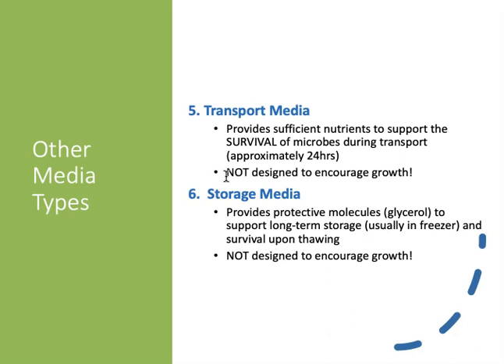There are kits that physicians use at the bedside to do things like swab lacerations or swab the back of a person's throat. And those swabs are then placed into a small volume of transport media so they can be sent to the laboratory.